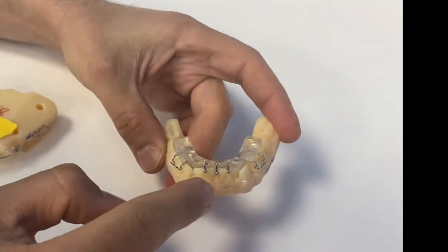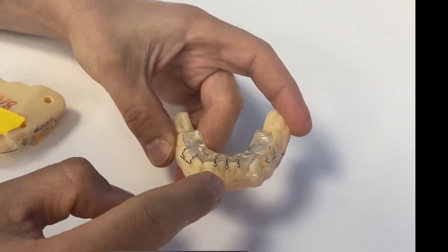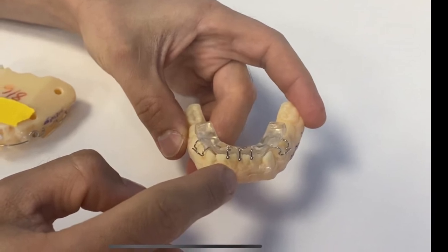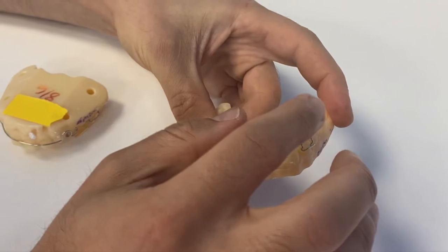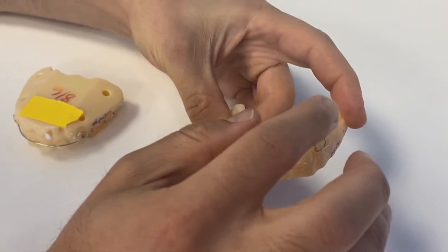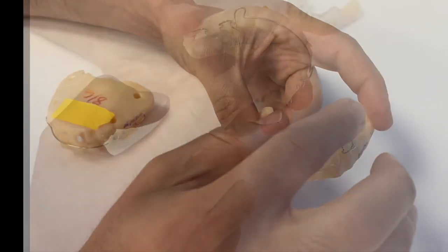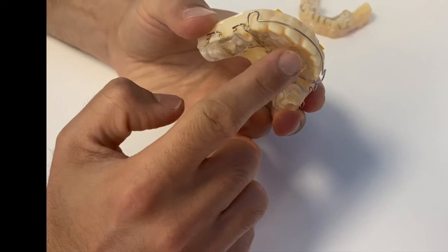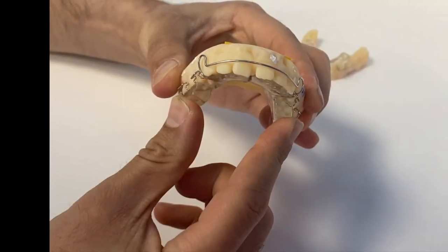In order to place the brace onto the teeth, for the lower component of a twin block type of appliance, you place it across the lower front teeth and then push on the blocks on the back section to secure it in place. Sometimes you may hear a little clicking noise as this happens. For the upper part of the brace, you put the front section behind the upper front teeth and similarly push up to secure it in place.